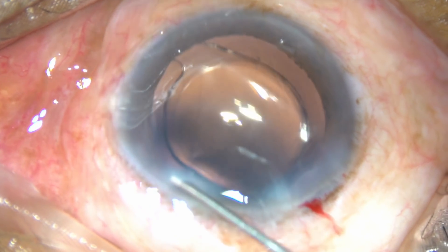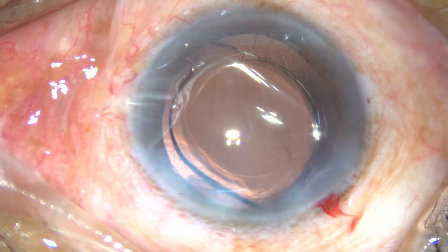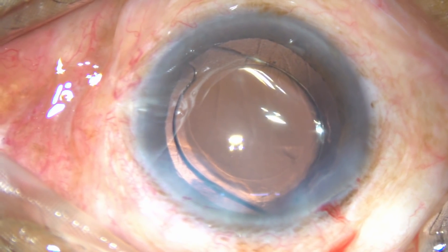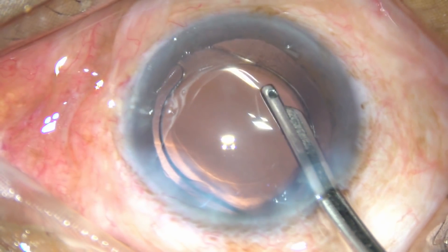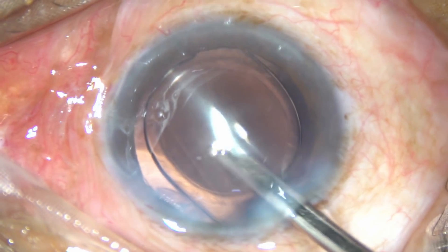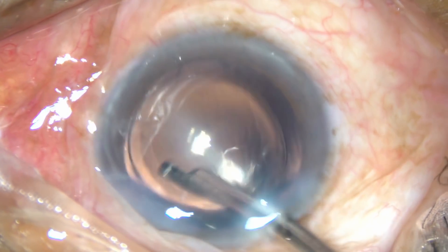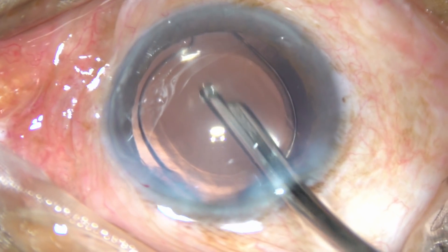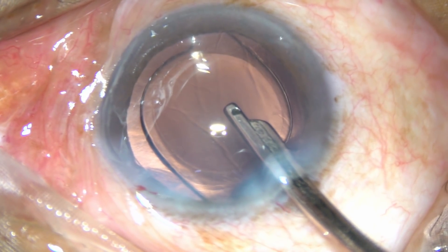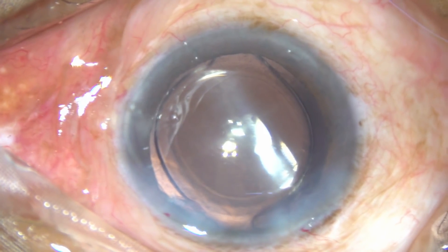Hydrate the side port. In this case I have made only one side port, but you can use two side ports or bimanual — that is your choice. This is the final lavage of the anterior chamber. The final lavage is done, the anterior chamber is formed nicely, all the viscoelastic substance is removed, and the case is concluded.